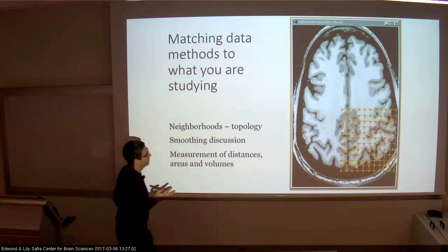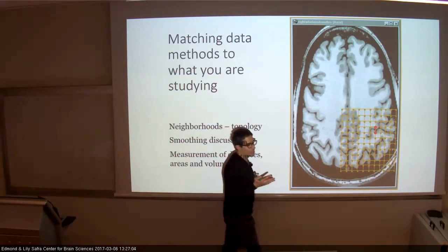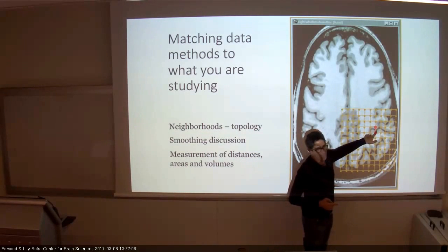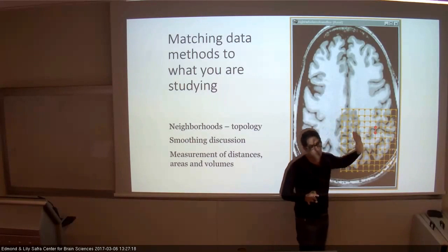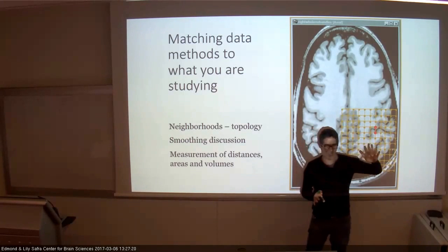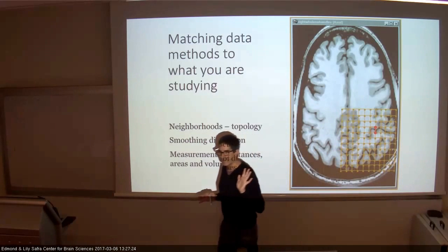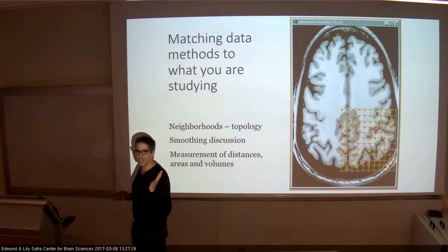Smoothing essentially means you take several measurements. So if you smooth in image space and it doesn't respect the coordinates of the brain, that will make one kind of measurement, versus if you smooth along the surface, it will be a different kind. You can smooth along the surface, you just need to first calculate the surface. That will make it a totally different observation of the brain, right?